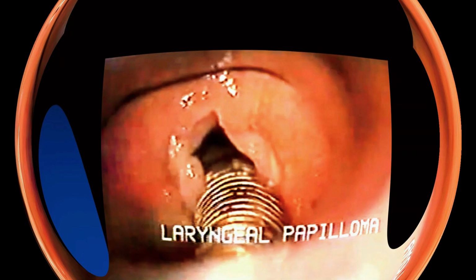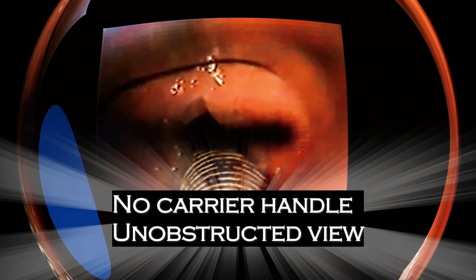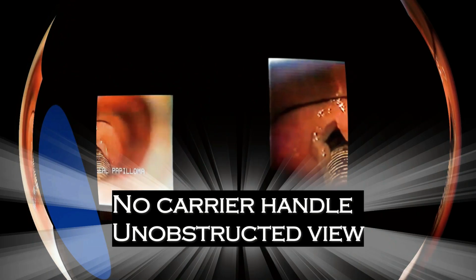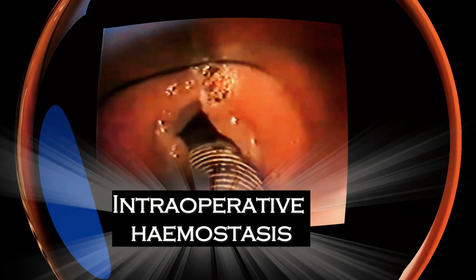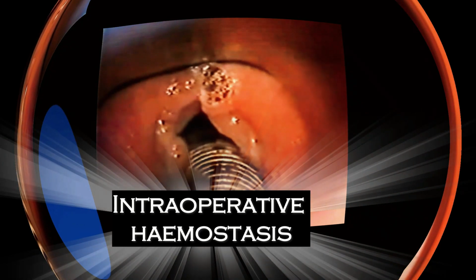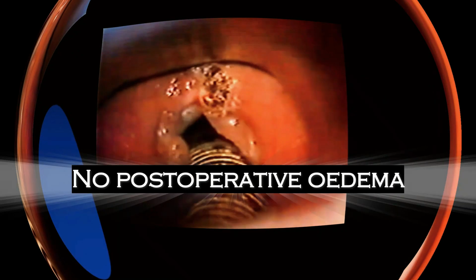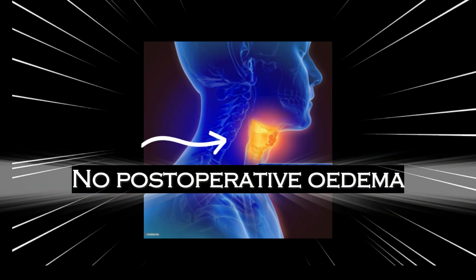Using the laser in the larynx had obvious advantages. The beam did not need a carrier handle. The view of the operating site thus was unobstructed. Intraoperative hemostasis was another advantage. With our experience of using the laser in the oral cavity, there is very little postoperative edema after using the laser. An obvious advantage in the larynx, thus avoiding any possibility of airway obstruction.